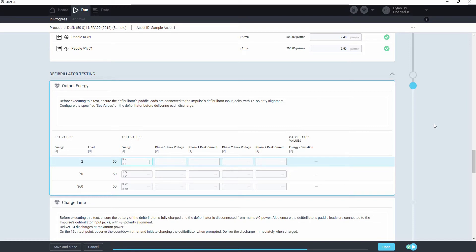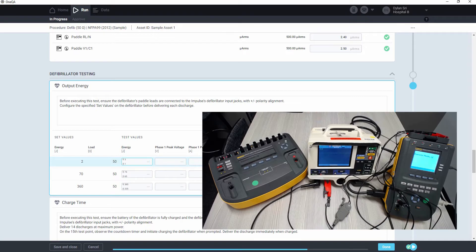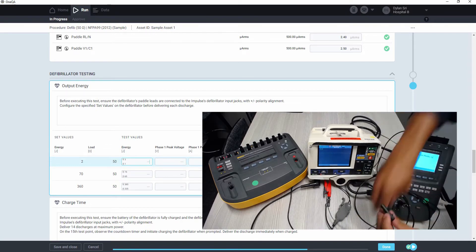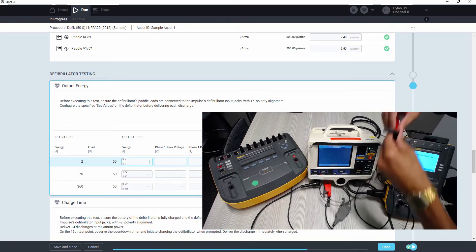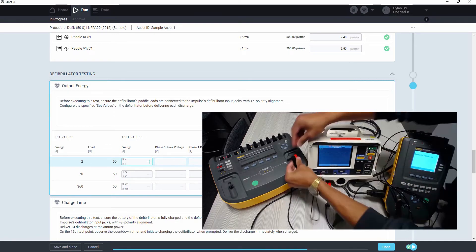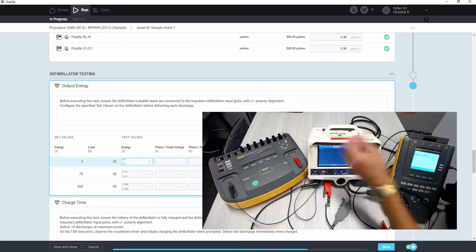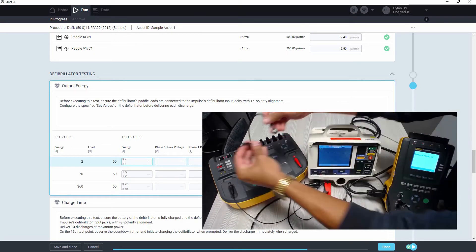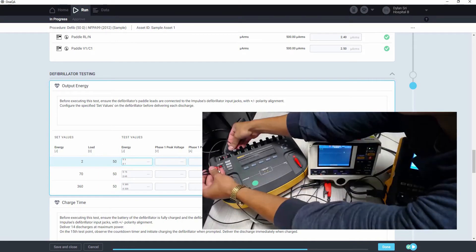We'll follow these instructions for the output energy test, so we'll need to reconnect our leads to the impulse, making sure that we have the correct polarity for these paddles into the paddle jacks on the impulse. We can go ahead and connect the ECG leads as well, so that lead forms can be simulated.